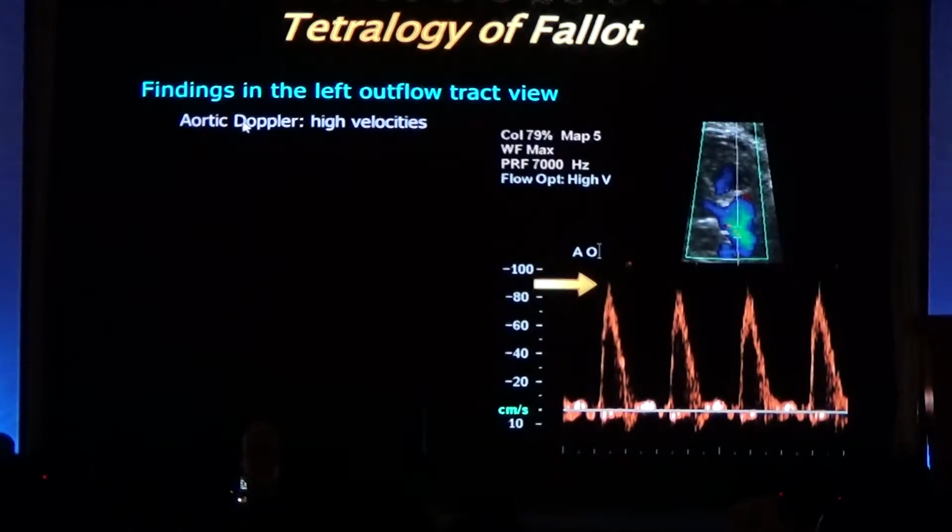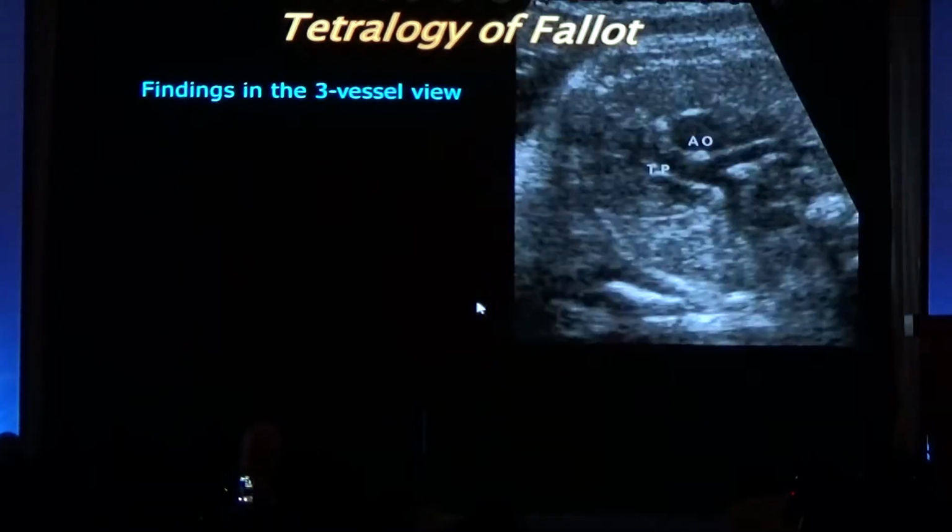Now, in the aorta, the Doppler will show some high velocity. What is the maximum velocity in the aorta? Anyone brave? It's 1 meter per second. Aorta, pulmonary, and ductus, all 1 meter per second. So up to 100 centimeters per second, here we're fine.